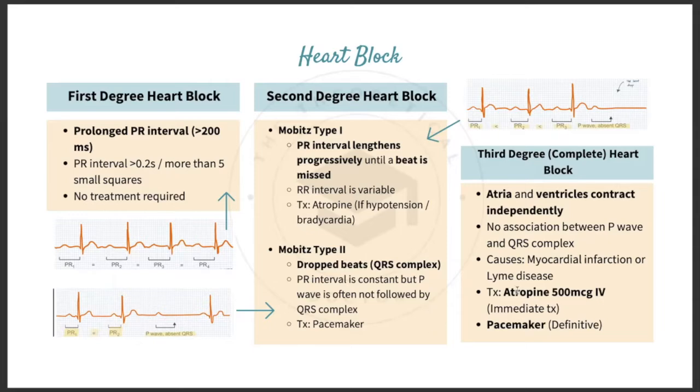I know I didn't include the ECG for the complete heart block, but basically in the third degree heart block, it's not as uniform as this, you see. Basically, everything is kind of just neat. But in third degree heart block, it's all haywire.